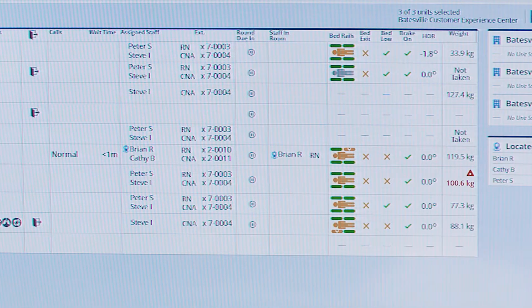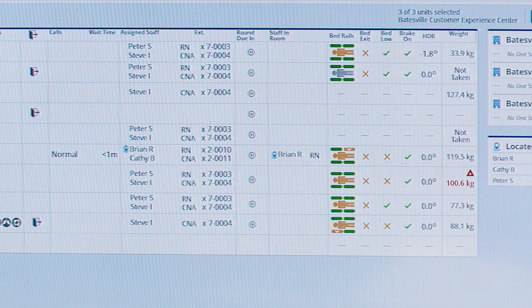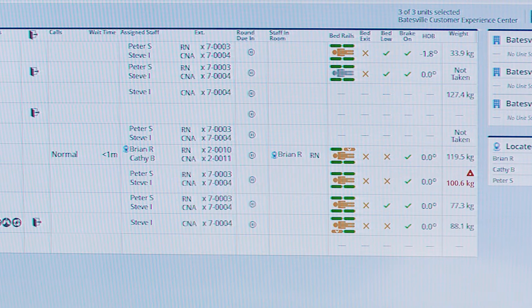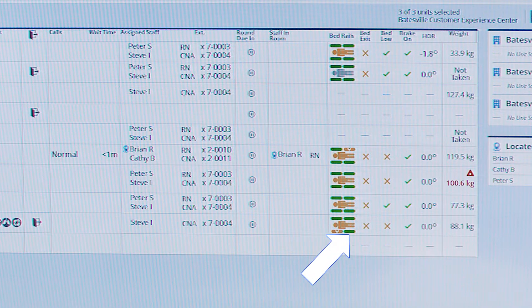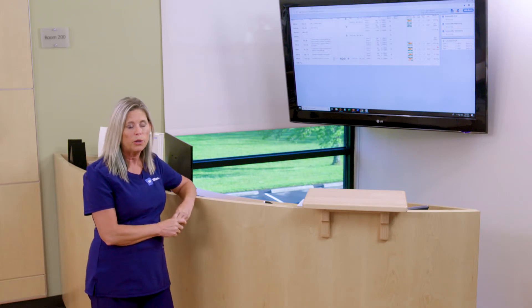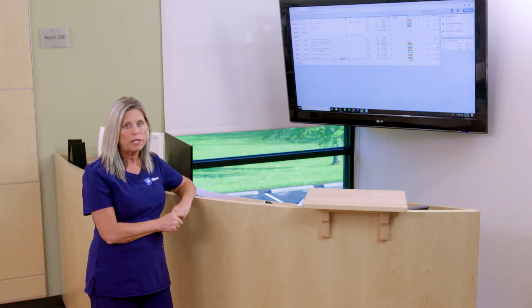We may have visibility to assigned staff as well as staff in room. We can also see rounding times and rounding due times, as well as bed data. Now here's what's going to happen: we're going to see information occurring in real time.